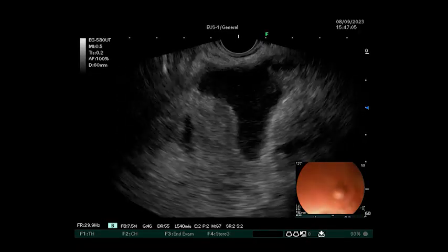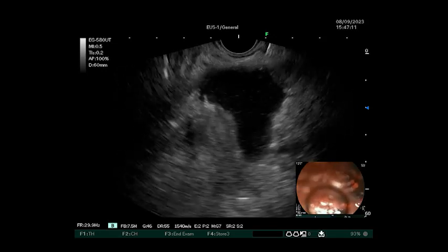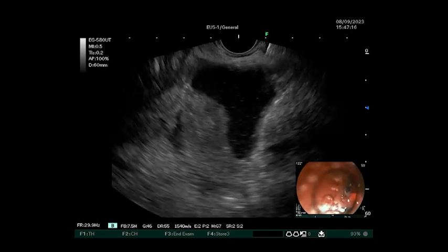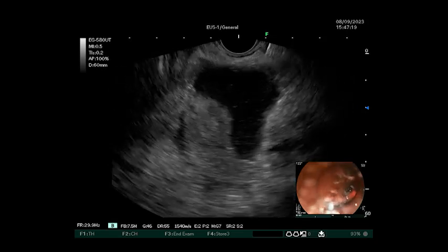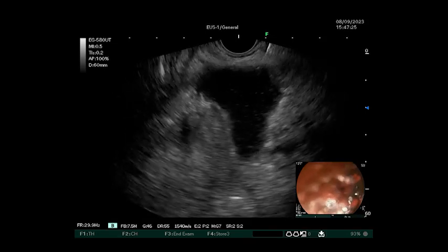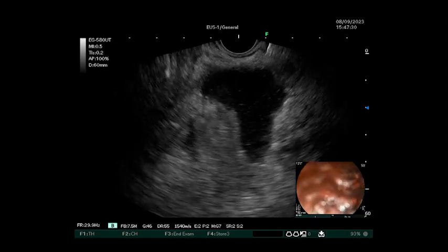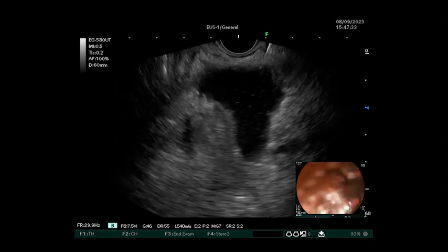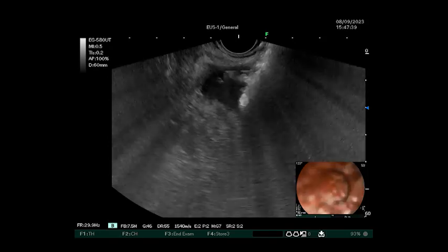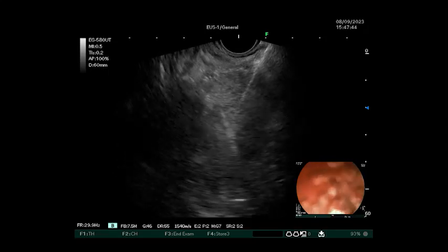The advice we can give is to go inside in AutoCut setting using the RB processor. Because you have to go inside the collection very quickly, you don't use the current after pushing the catheter. You first apply the electrocoagulation current and then push the system. Like this, you are inside very easily and rapidly.